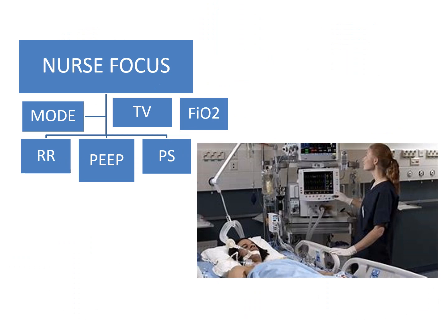Your physician orders will provide these parameters. Nurses usually are responsible for knowing all these settings, and the respiratory therapist is responsible for knowing and setting these and more. So we talked about the sensitivities, the IE ratio, the flow rate. As a nurse, you may not know all of those, but the ones you should know are the mode, whether it's volume or pressure or a combination, the tidal volume that is set, the FiO2, the respiratory rate, the PEEP, and if the patient has some pressure support. Those are the settings that the nurse should know and have documented.